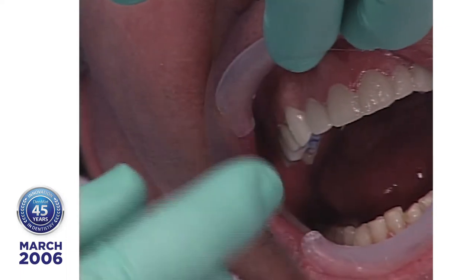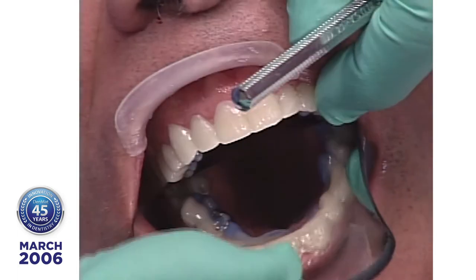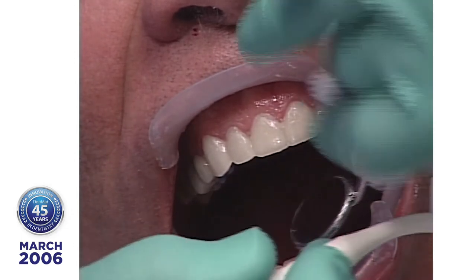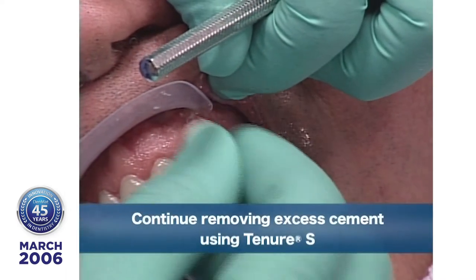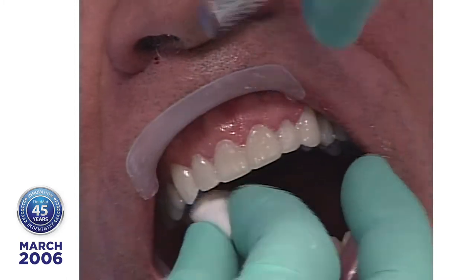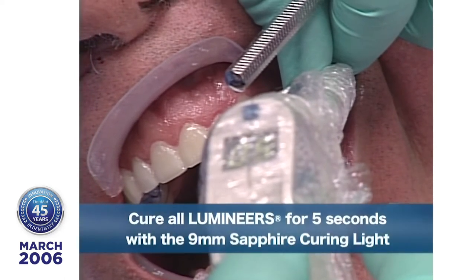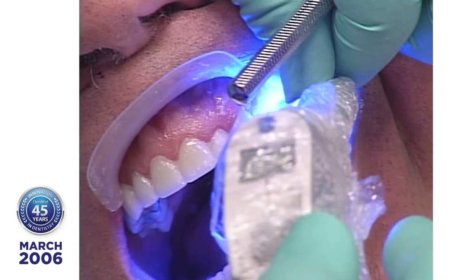So I'm going around now, checking everything out, removing a lot of the excess. And I will take a brush and wipe a lot of that off. Now I can see that I've got ultrabond between the porcelain everywhere. And I've got a little Tenure S on here, and I'll wipe some of this off. Now think about what I'm going to do. I'm going to bond 10 Lumineers in about 1 minute. 5 seconds, 9 millimeter tip.